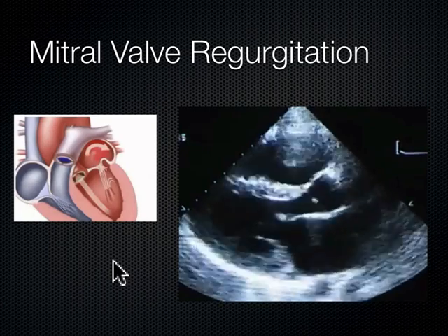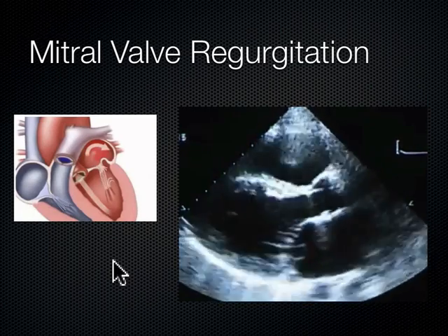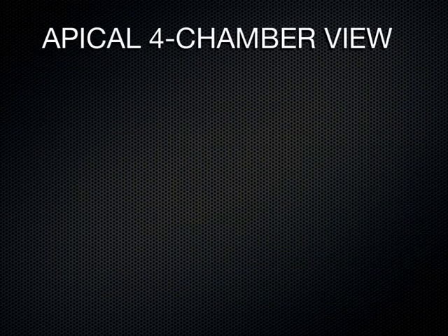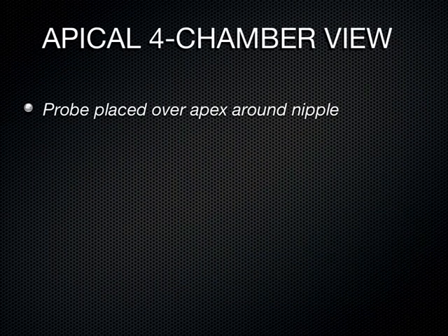That's a fancy adjustment you can do on the machine. Now we're going to switch to the apical four chamber view — this is probably the hardest view of the heart to get, the most challenging. It requires a lot of patient positioning; it's particularly difficult in women with large breasts because you've got to move them out of the way. This is the one you're going to struggle with to obtain, but it gives you the most bang for your buck.